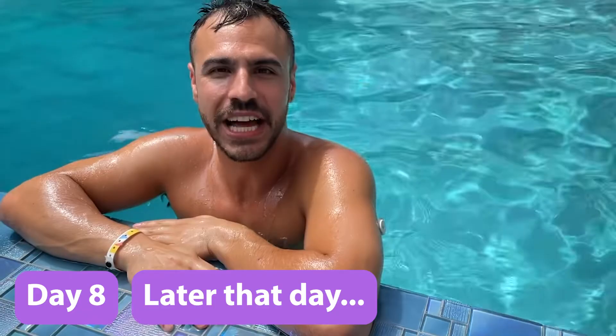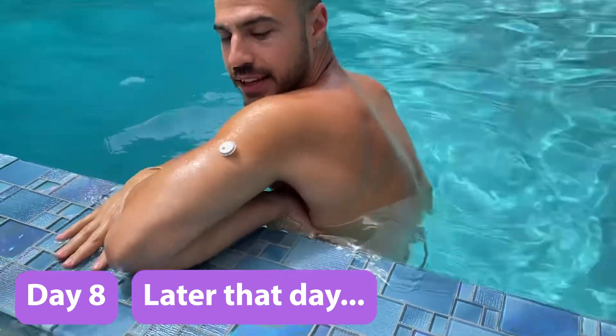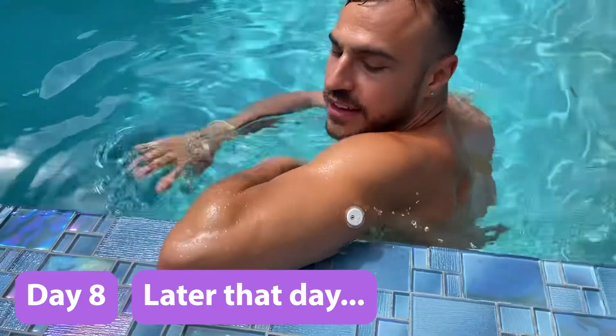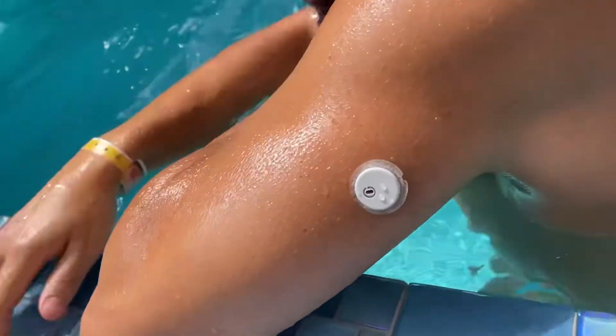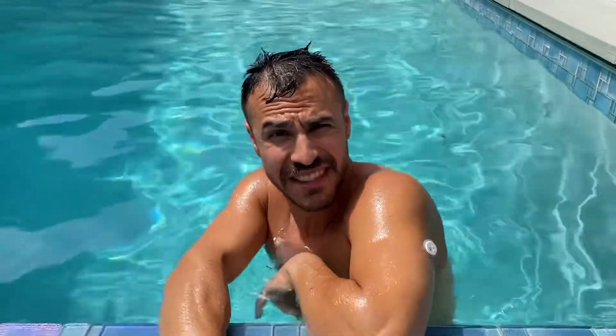Still on day eight — I just jumped in the pool and look what happened. The Libre 3 officially has come off. I guess what I would have needed was an overlay patch, but good to know. I feel like the Dexcom G7 tends to do a bit better, even in the full 10 days.